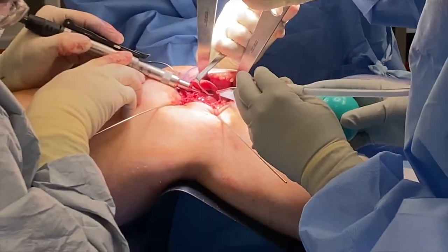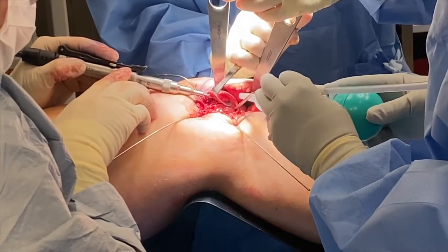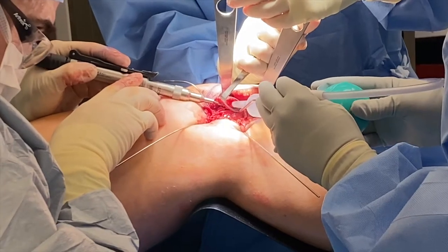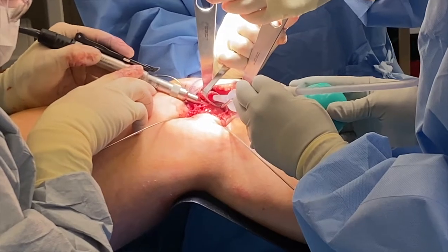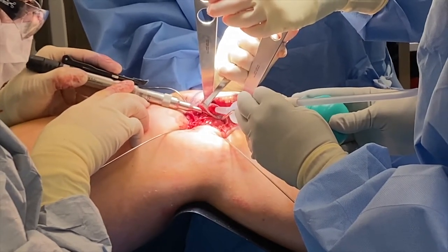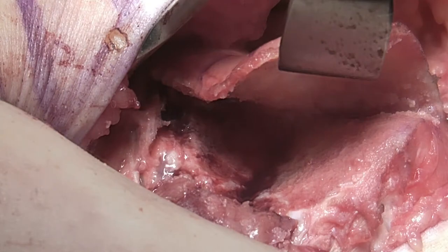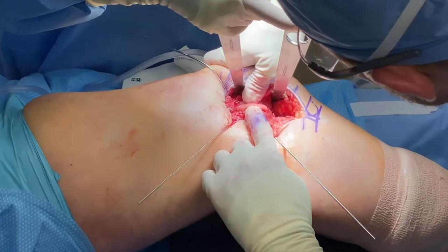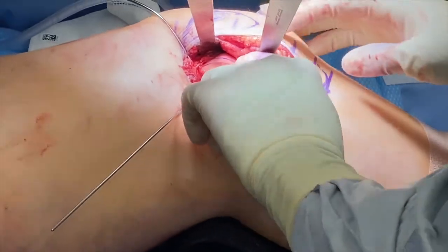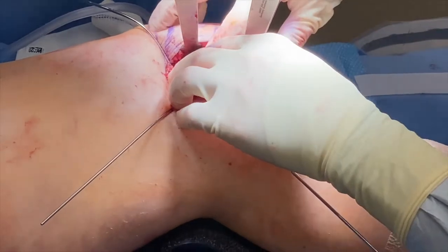Following that, I use the burr to thin the flap of cartilage and bone. I need to do this because we have to create some mobility or flexibility within this flap so that I can compress it down into the new groove and allow it to mold without cracking the cartilage. Here we see that new valley I've created, and this is the chondral flap we've elevated. Once that flap is flexible enough to mold completely to the distal femur, we want to secure it in that position.